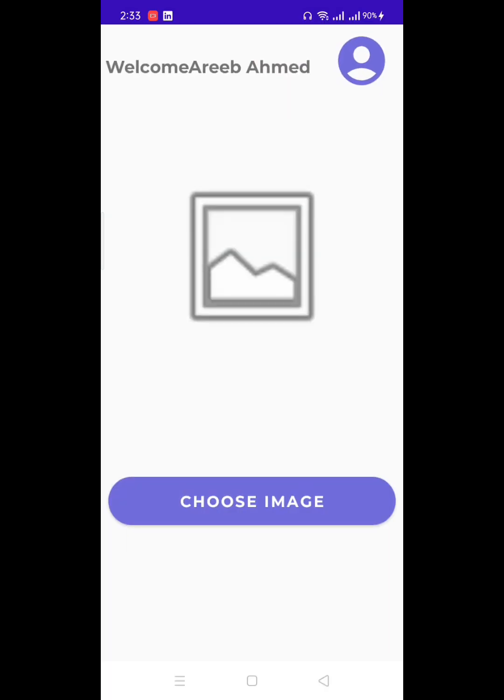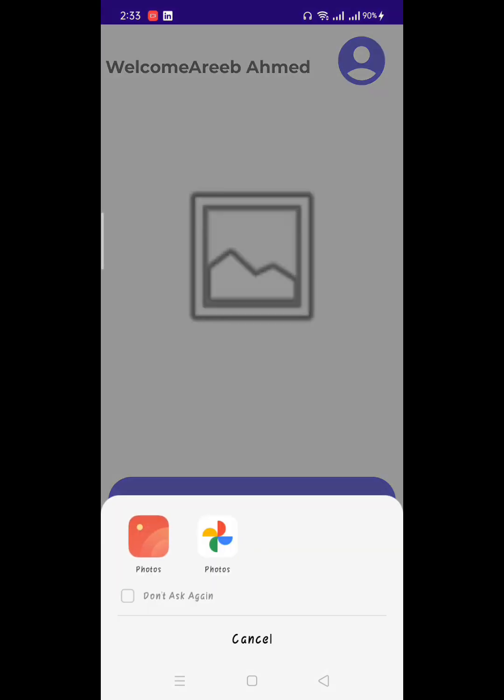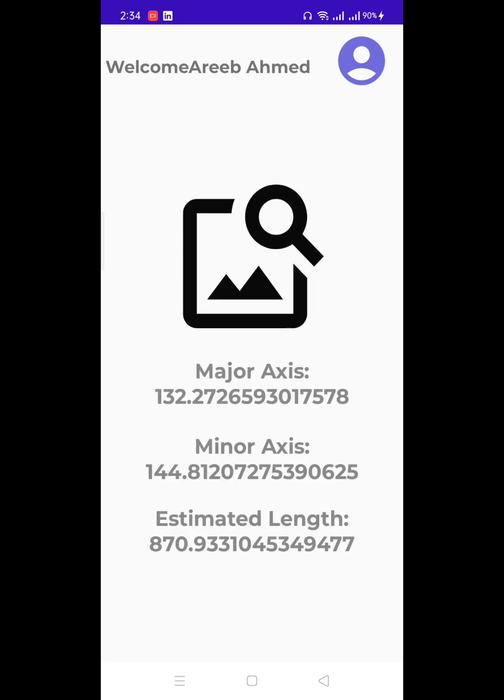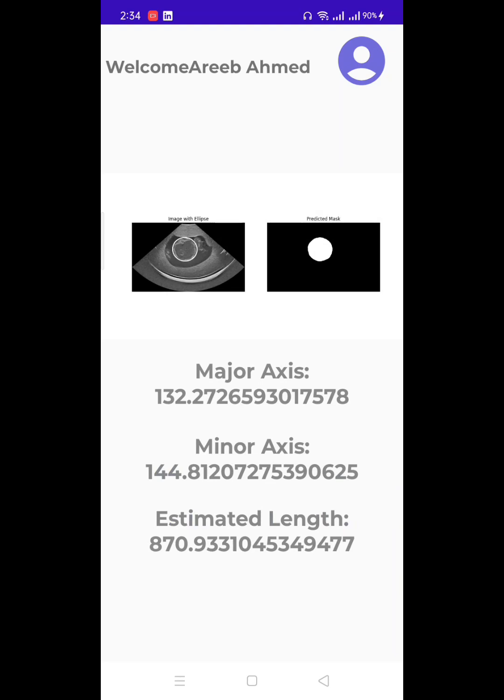I click on abdominal, and here I have to choose an image. So I simply click on the choose image button, and it takes me to my gallery, from where I have to pick my image. So here are my folders. I click on this one, I pick an image of abdominal, and then I click on the upload image button. When I click on the upload image button, it goes to the server, and then it will check my results. So here are my results.